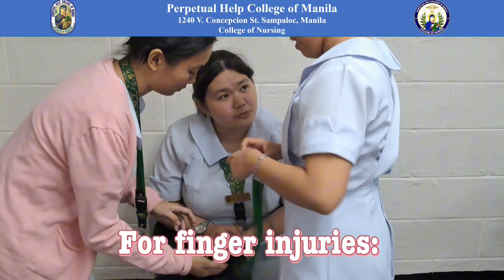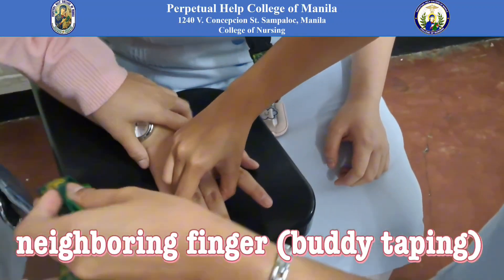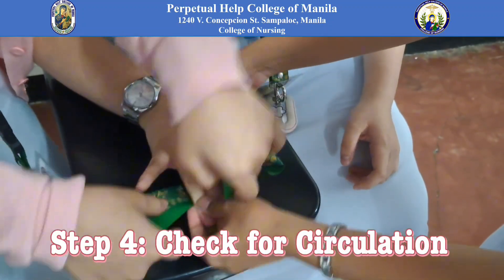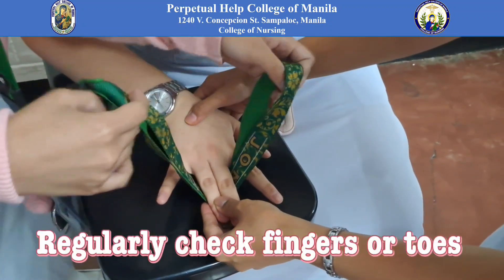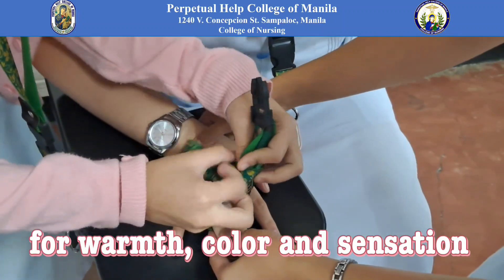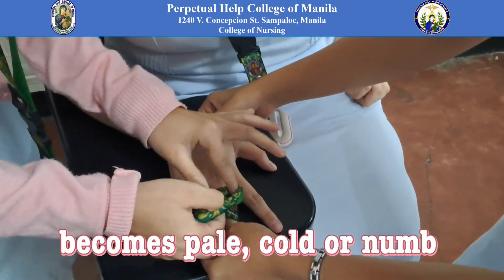For finger injuries, tape the injured finger to a neighboring finger — buddy taping — or use a small splint. Check for circulation regularly. Check fingers or toes for warmth, color, and sensation. Loosen bandages if the limb becomes pale, cold, or numb.